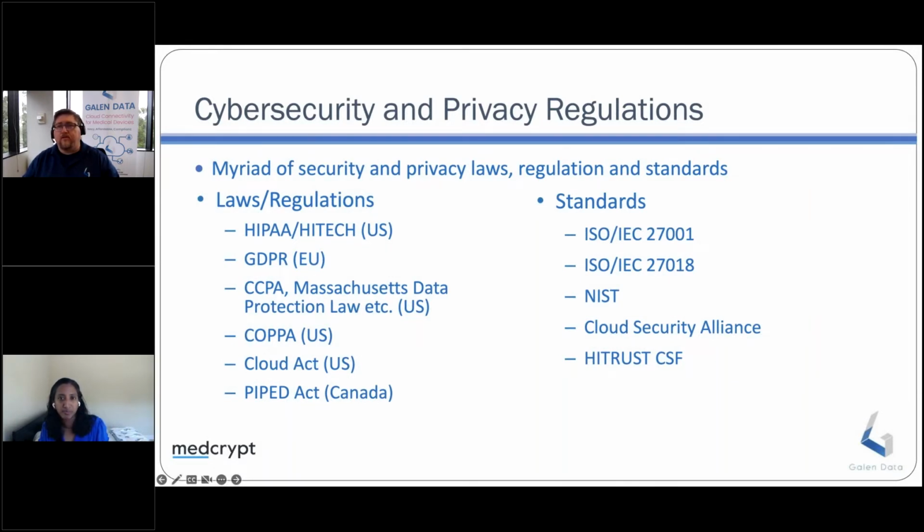Just as an example, in January of this year, they enacted part of their Privacy Act that mandated every individual device has its own unique token to communicate with the cloud services, which seems pretty obvious as a best practice to do, yet they had to mandate a law to actually make people do it.